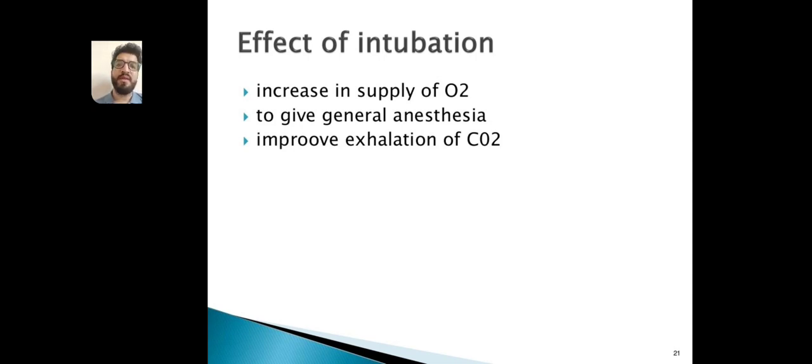And when we talk about the positive effects of intubation, it can increase the oxygen supply to the patient. It can be used to give general anesthesia, because in general anesthesia we have two particular methods. One is when we give it through the veins, which is intravenous induction, and when we give it through the endotracheal tube, that is inhalational induction.